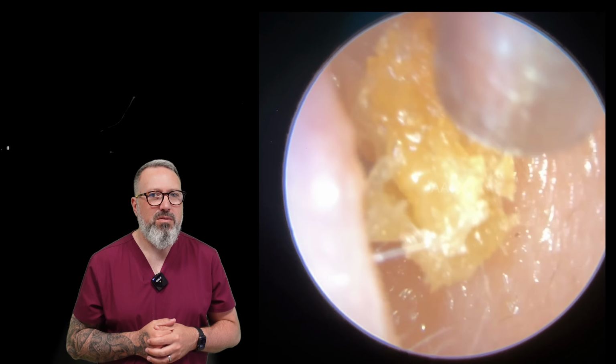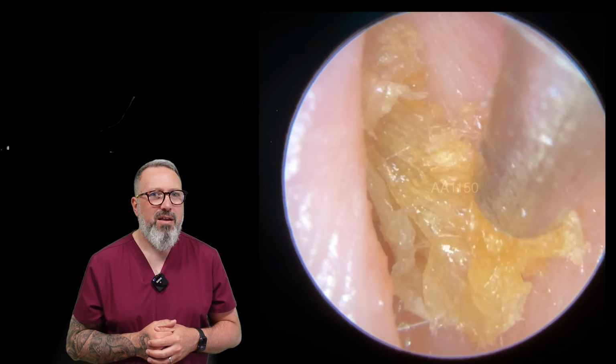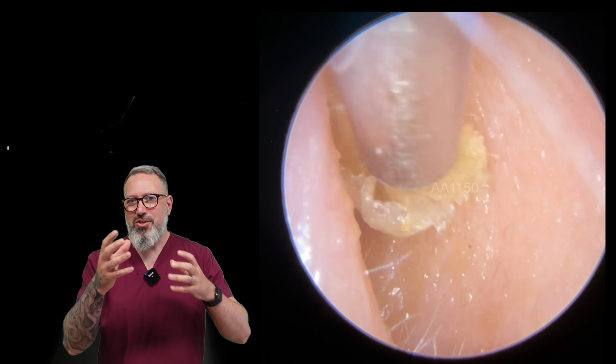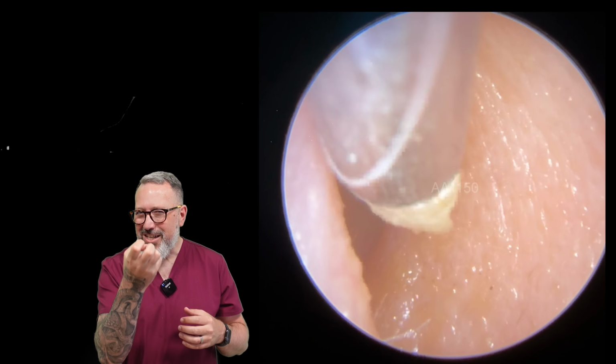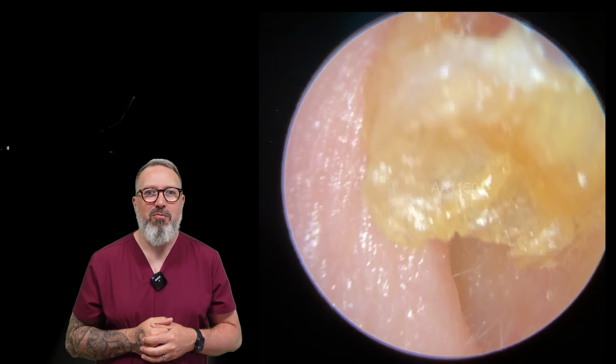There we go. There we go. And again. And I'm just pulling down. It's just this back section is anchored in there, a little bit firmer than I need it to be. And that's why we have to do a really good old wiggle, and we just attached it there.